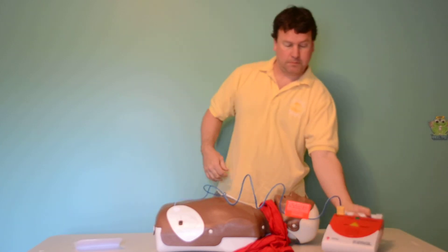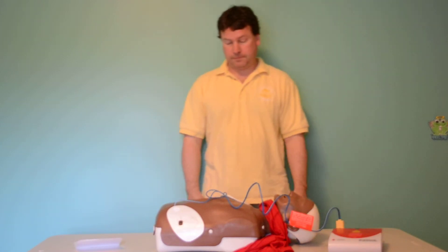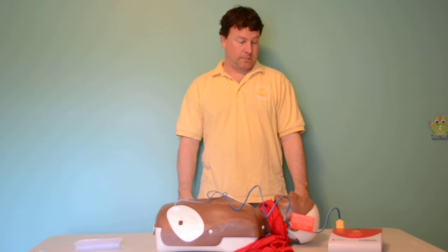Analyzing rhythm. Everyone stand clear. Shock advised.